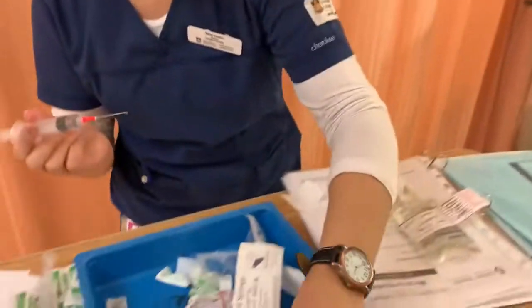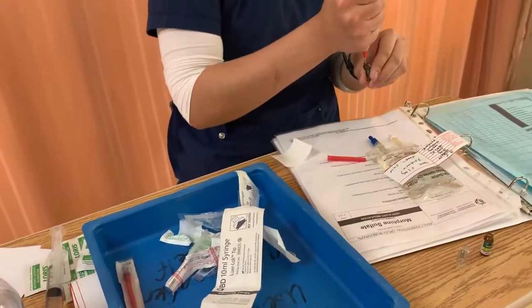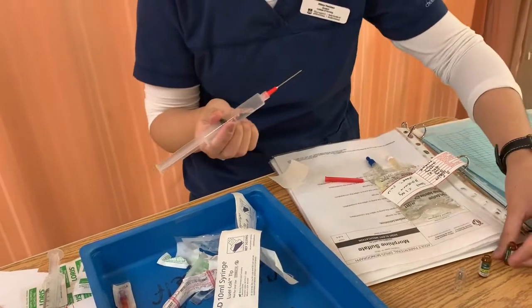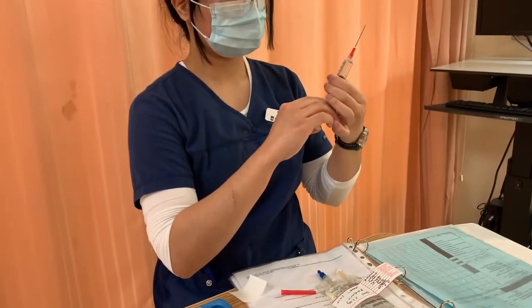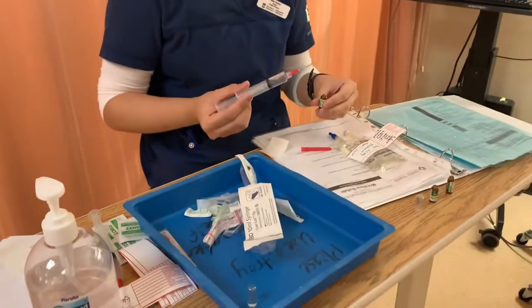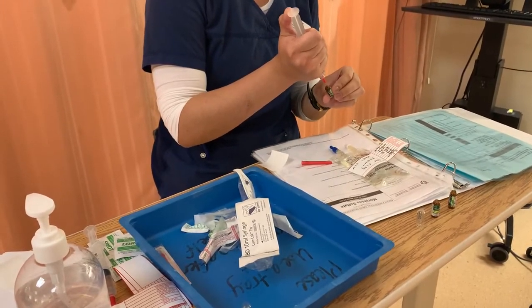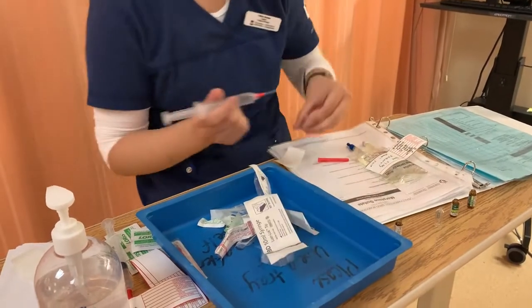And we need to make sure that we have 5 ml in total here. There we go. Okay, so we got 1, 2, 3, 4, and each of these contains 1 ml, so it has to have 5 ml in here.